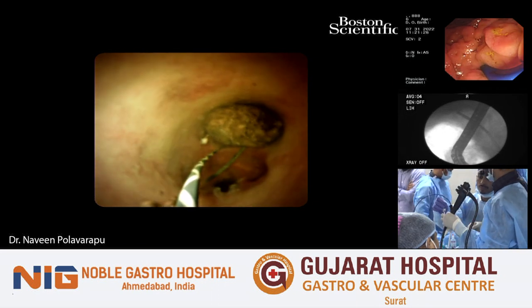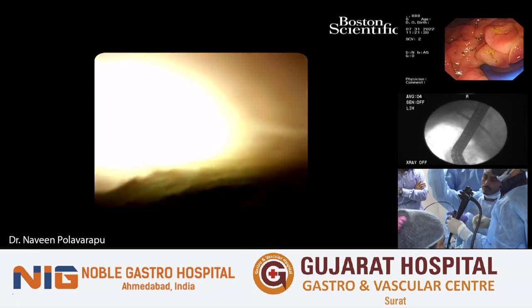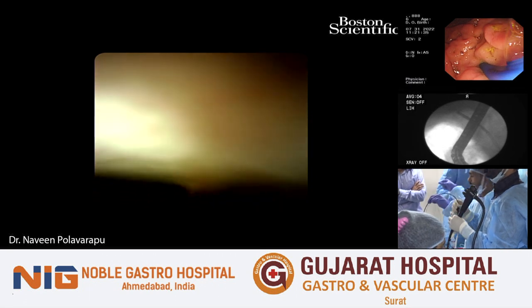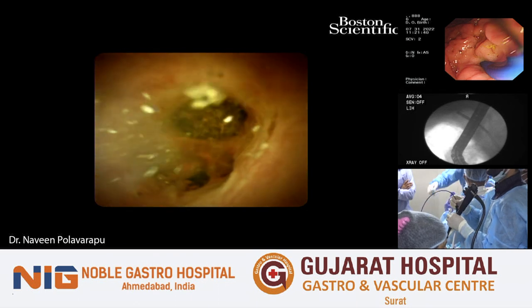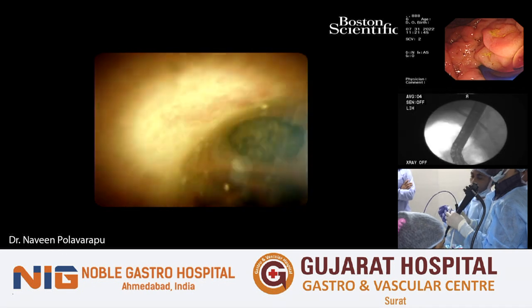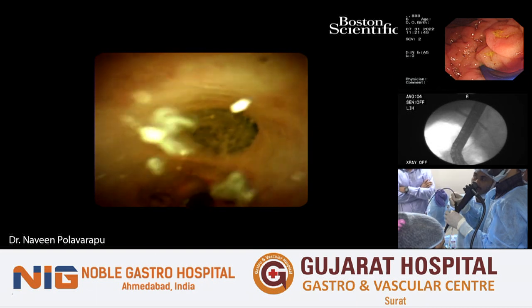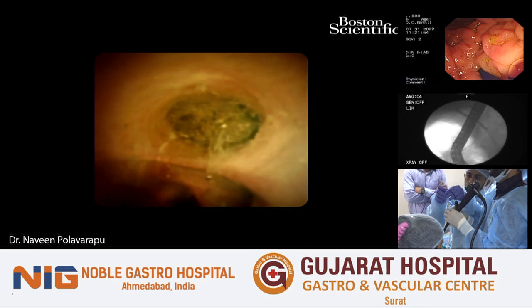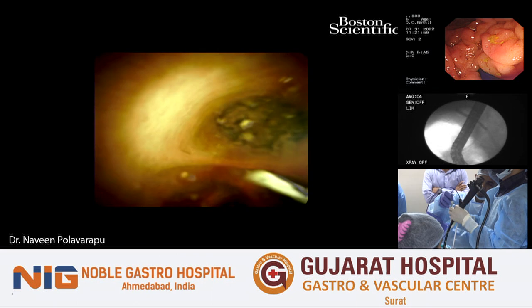Okay, remove the wire. Having a water medium is very important for the EHL to work. And as Dr. Mahesh Goenka mentioned this morning, you should create a bubble there with which the stone breaks. So always try to get the stone in the nice center of the screen.